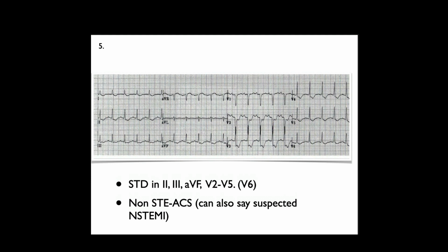Yeah, it wouldn't hurt to check for possible posterior. It's also very widespread. There aren't R waves in V1 and V2, but yeah, you could always check. There is a bit of ST elevation, so you're fine adding the left main. I don't have it here, but I think you're okay adding it.